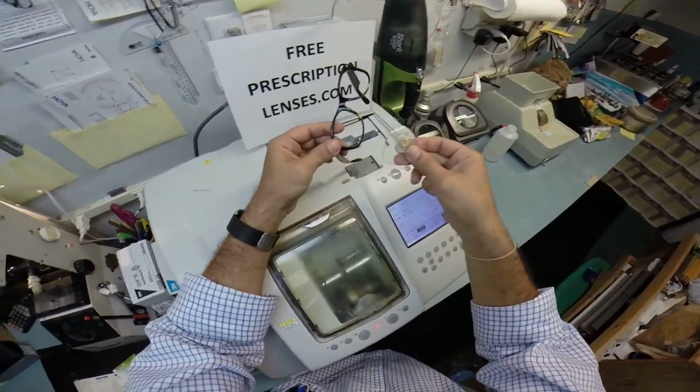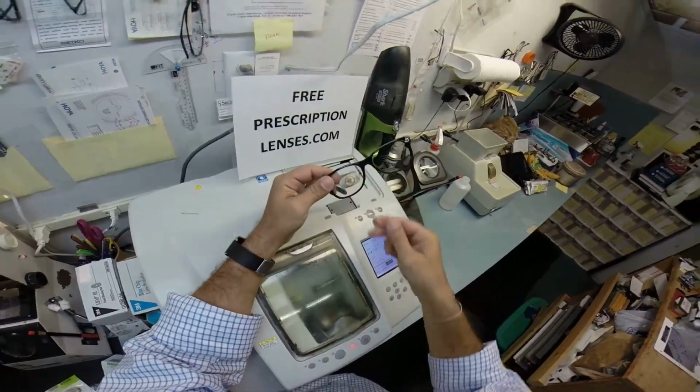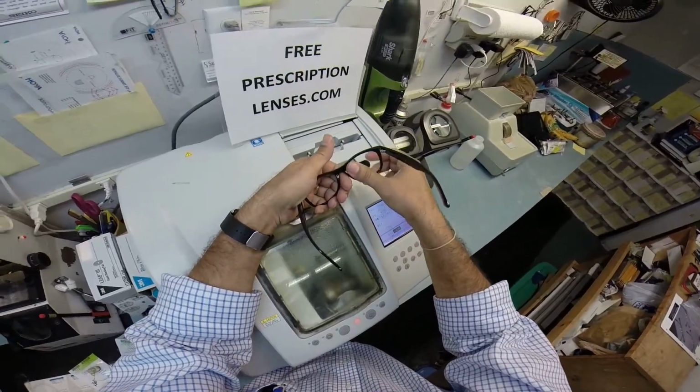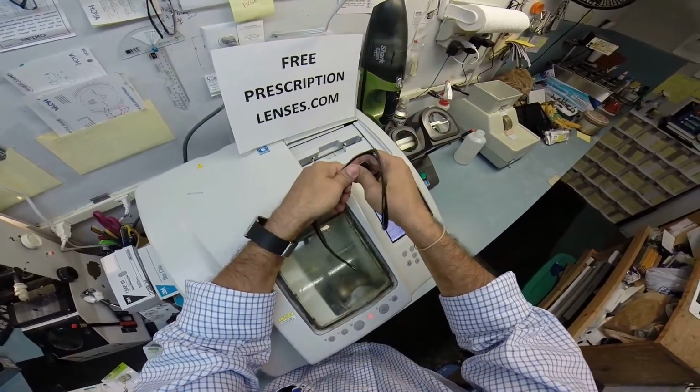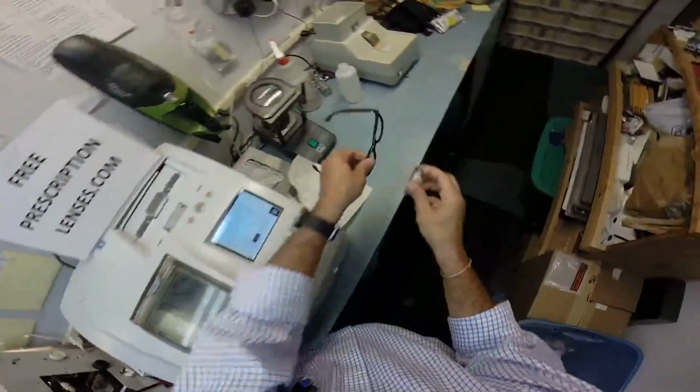So let's go ahead and see if the lens will fit. I'm going to tuck it in at the outside corner, and using my thumbs, I press down at the nose. It does. I just want to test it by popping it back out. I'm going to place my thumb at the nose, put my other thumb on top, and push down. Pops out well. So I think we're good on size.